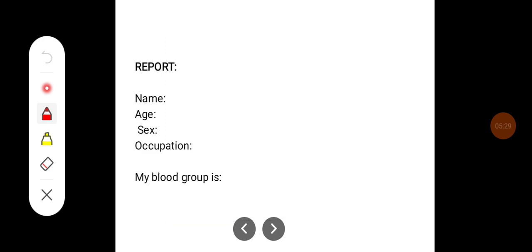The result is to be reported in the following format: the blood group is A positive or A negative, depending on the agglutination.